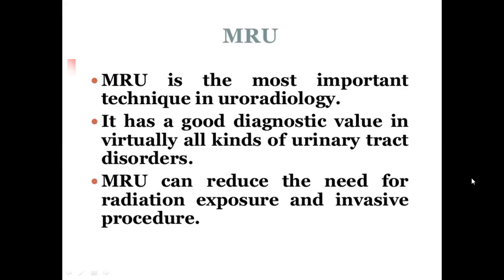MRI of the urinary tract is the most important technique in uroradiology because it needs no exposure to X-ray. Of course, it's an advantage of this study. It has a good diagnostic value in virtually all kinds of urinary tract disorders. Any problem, any pathology may be found on MRI study of the urinary tract.